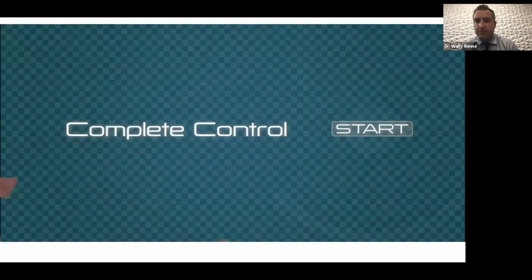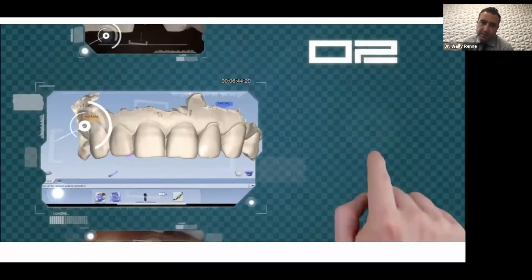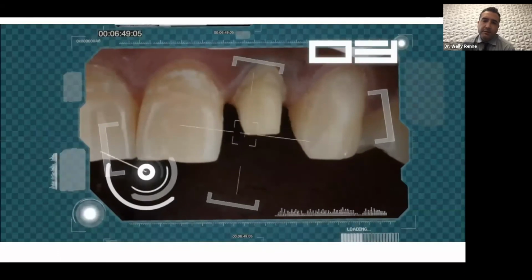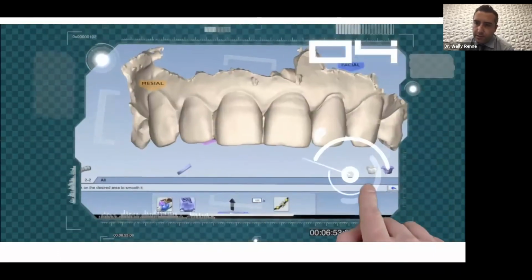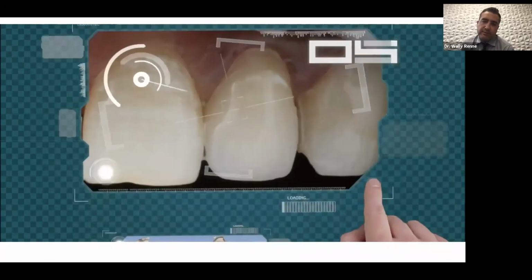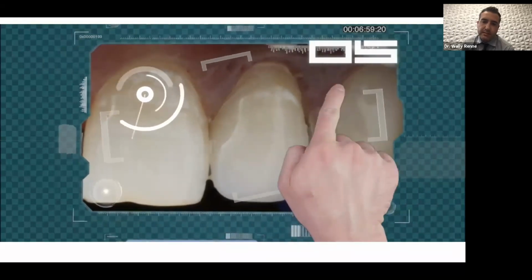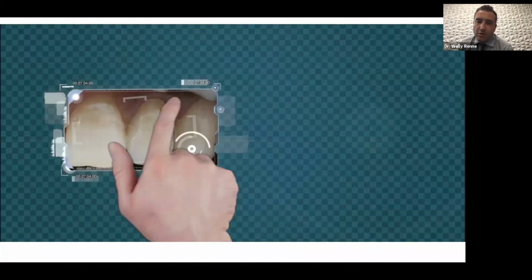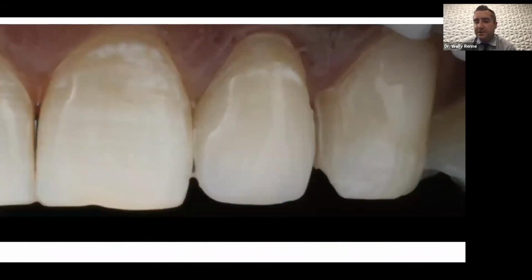And so let's go through, when do we use Smile Design? Everybody knows that I love chairside milling and I love doing CAD/CAM dentistry. For the most part, you don't need to do Smile Design for 1 or 2 units. So in this case here, we have a lateral incisor, and we chairside milled it out of Emax there on the 30S mill. It's overkill to try to do any kind of Smile Design with a single unit. It's just not necessary.